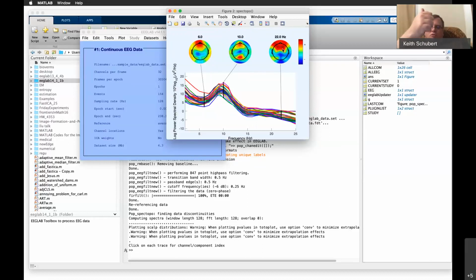So when you have to do the reaction time to give the response, this is probably doing the what should I do? And that's happening in that mid to high beta range, like we said, somewhere around 22, 23 hertz. Yeah, 22 hertz. We're getting a response here where the channels are measuring that this person is thinking about how to actually press that button.